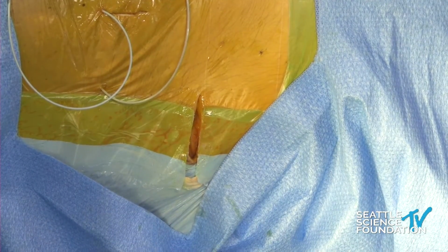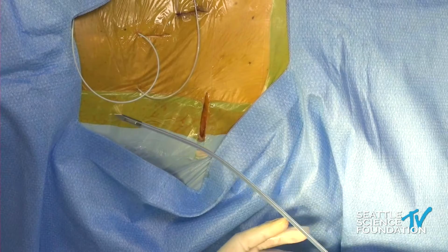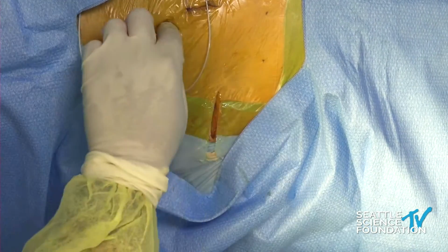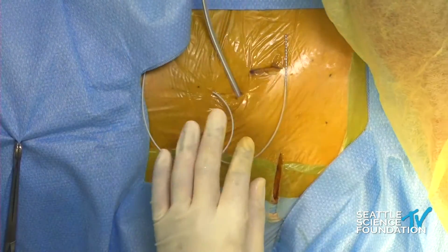For the tunneling tool, what we do is we put a little curvature here, and you have a couple of tip options. Either you have a really sharp tip or a rounded, more blunt tip. Whichever one you choose is totally fine. So what I do is I finger dissect in the direction towards the IPG, and then I feel that plane of the adipose.